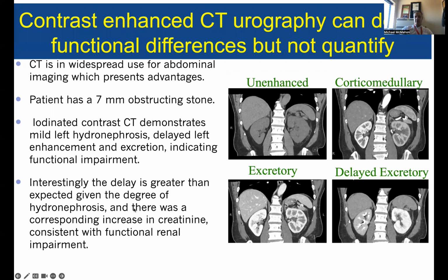And it's a greater amount of difference than you'd expect based on looking at just the collecting system and the size of that. There's not that much of a hydronephrosis. And so this is a patient where it wouldn't be expected there'd be such a big functional difference.